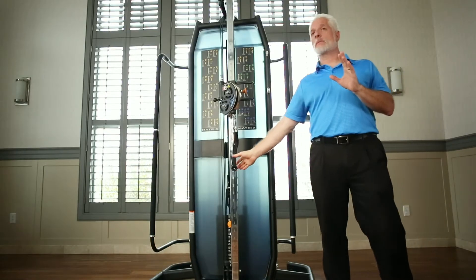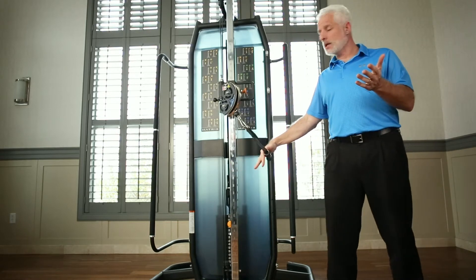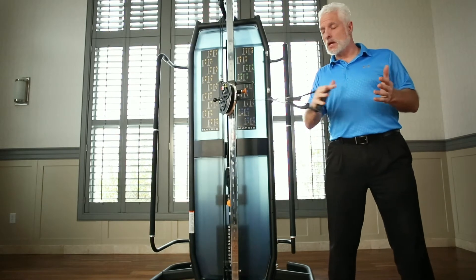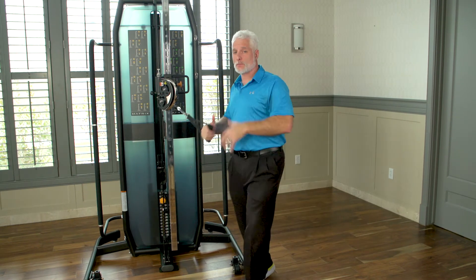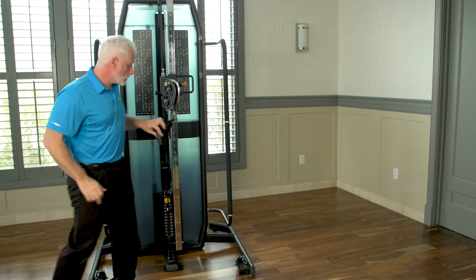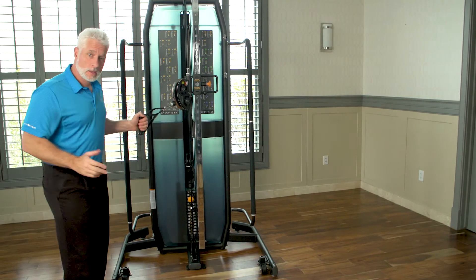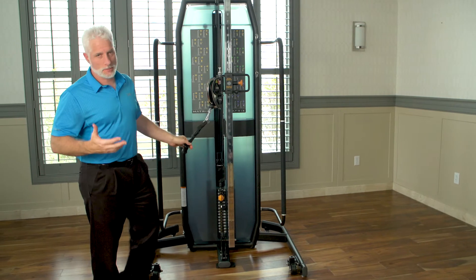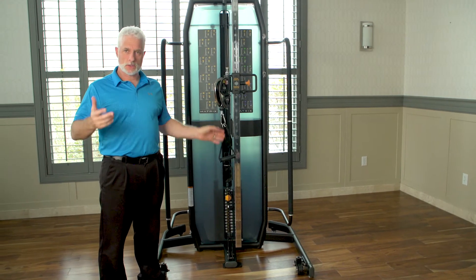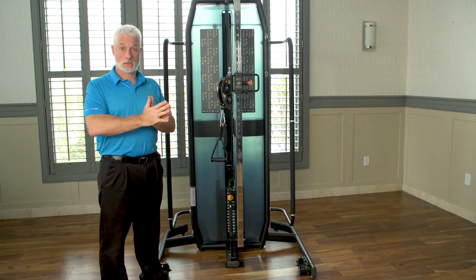If you have a rotator cuff repair patient six, seven, or eight weeks out of surgery, you can do different angle positions — you can come down, you can come across, you can go across the body as well. You can even do rotations, pulling this way and coming across this way. This machine gives you the ability and versatility to retrain these muscles and these patients in a variety of ways.